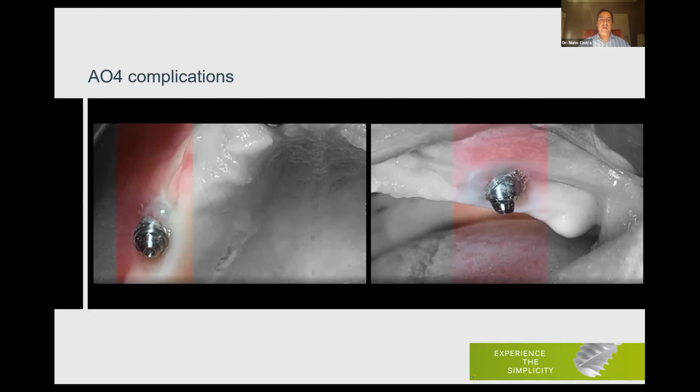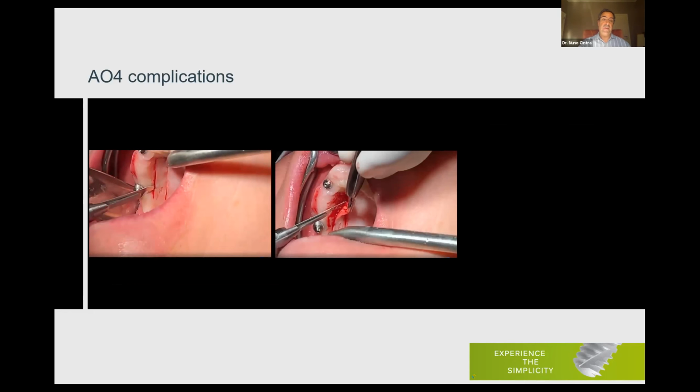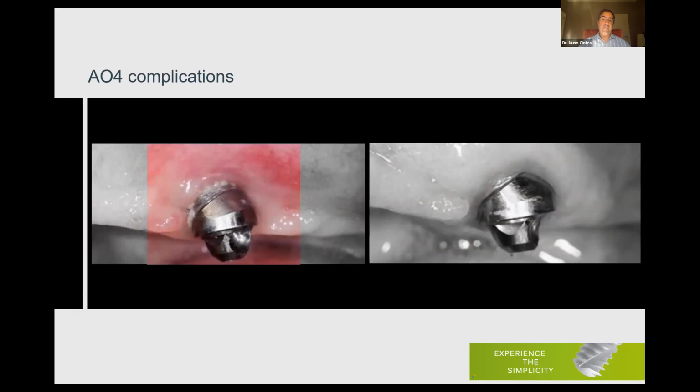When we are closing, we must make sure that we have enough keratinized tissue around the implant, around the abutment, because it's much easier to graft right at that point. We have everything open, we have plenty of soft tissue, so we can take a little bit of soft tissue from the palate and do a graft immediately. Otherwise, we have to do it later on. So we can go to the palate. The palate is a big friend of ours, and we can make a soft tissue graft around the implant in order to increase the keratinized tissue around the abutment.